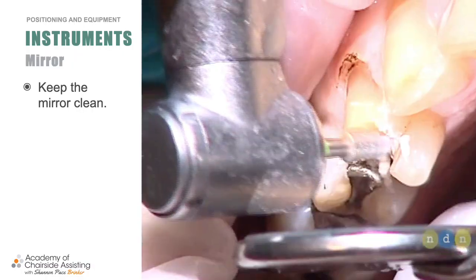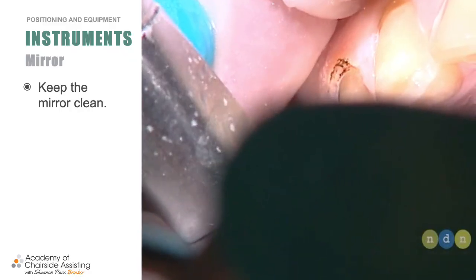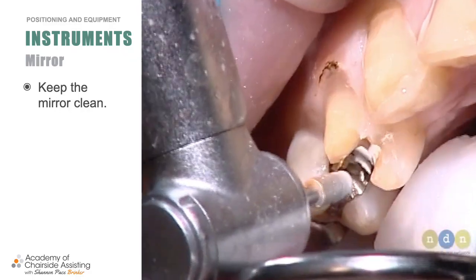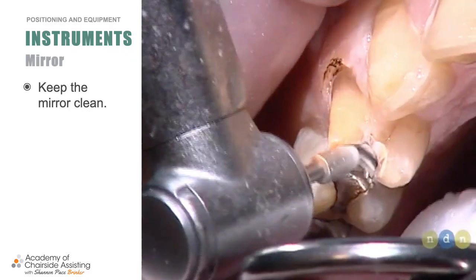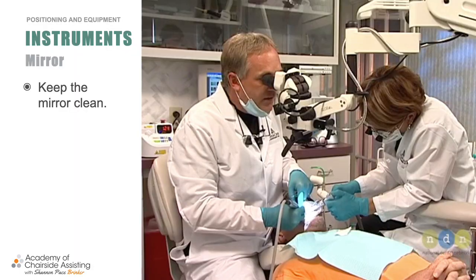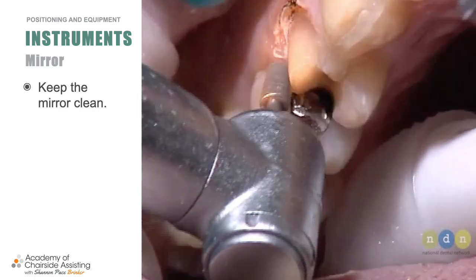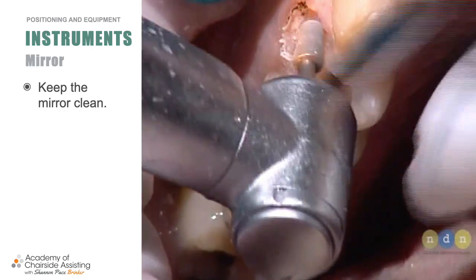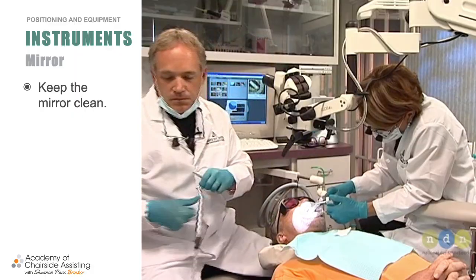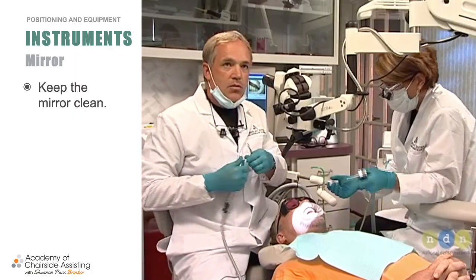You see that I'm constantly drying, rinsing, quick bursts of air and water at the same time, and suctioning. You see that? Just keeping everything nice and dry. I'm constantly going in. If you're a new assistant and you keep that mouth clean and you keep that air in there and keep that mirror clean, everything else will fall into place. I promise. Okay? You see, quickly rinsing, drying, wiping the mirror off.